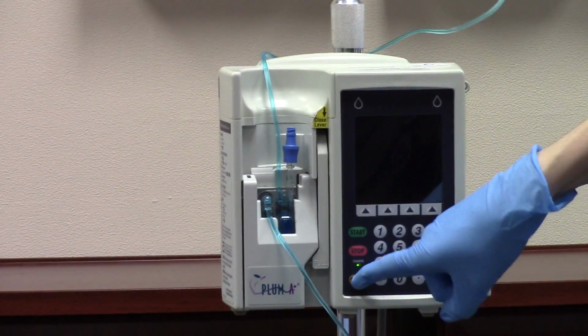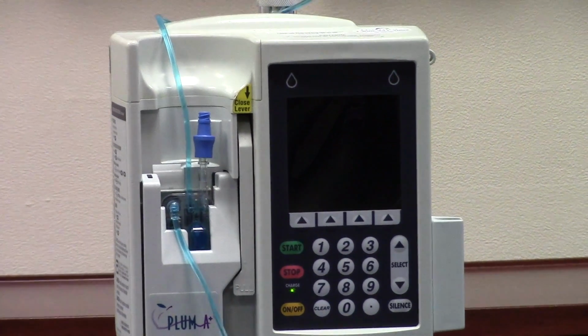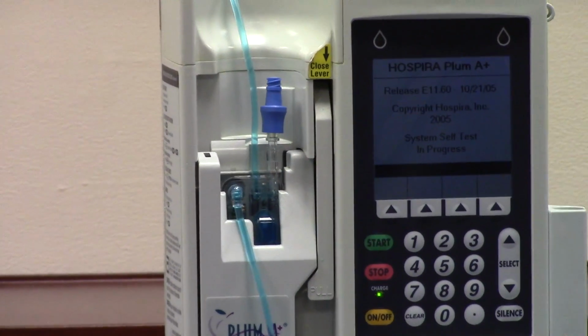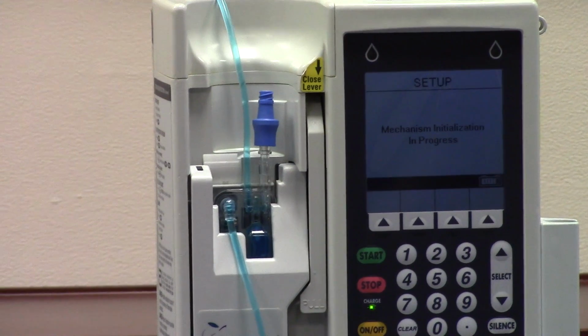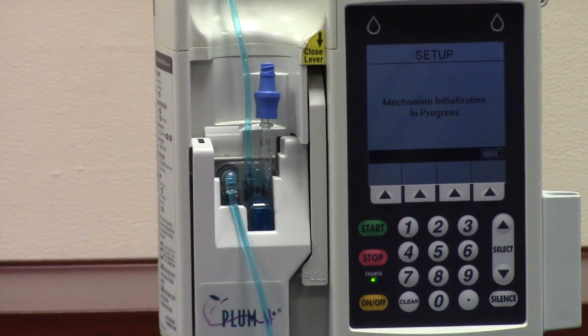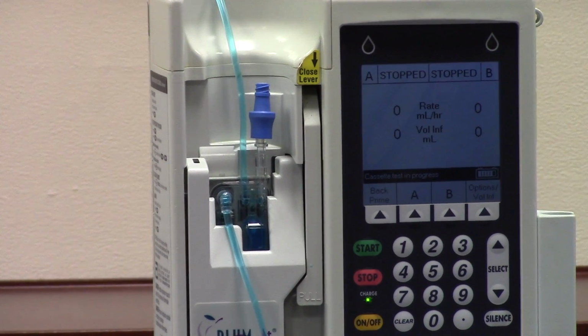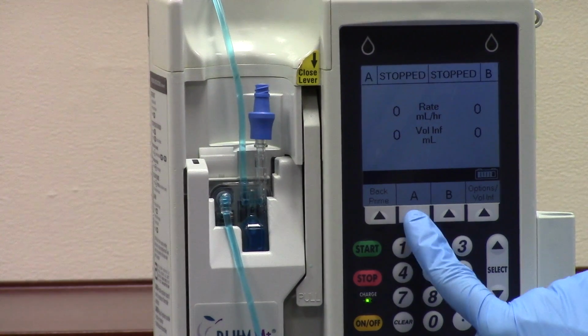On. It has to go through its self-checks before we can program it. So now it gives us the option to program either channel A or channel B. Channel A is our primary, channel B is going to be a secondary. So right now we're going to program a primary, so I'm going to choose A.